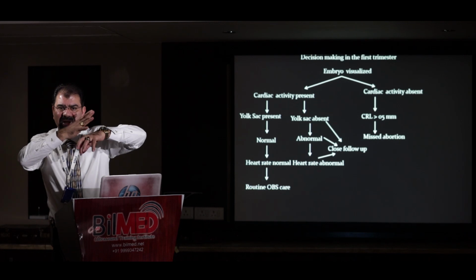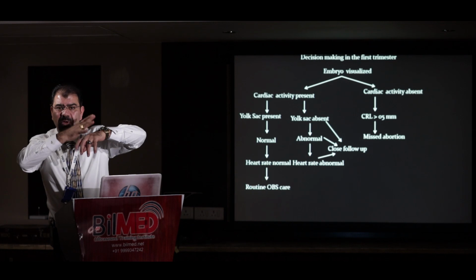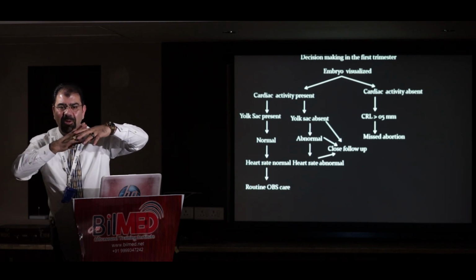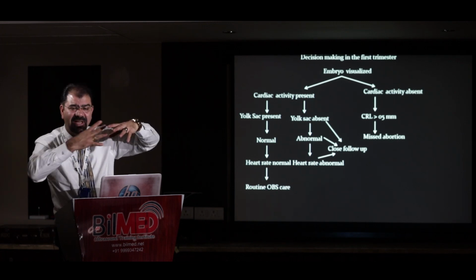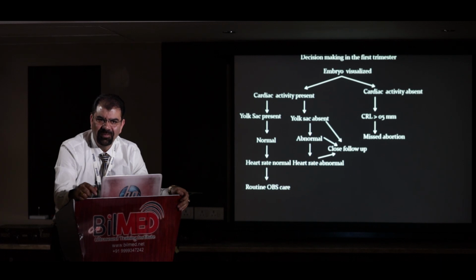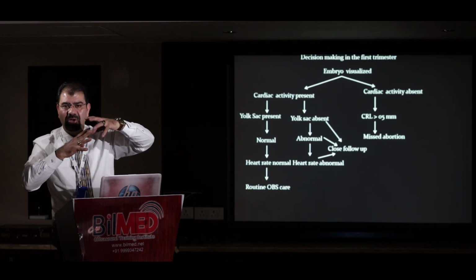Now color is not making any sense here. If you are putting color on this beating heart, now if you are already seeing with grayscale, what is the fun of putting color? So color is just to demonstrate to yourself that whatever you are seeing is heart only.